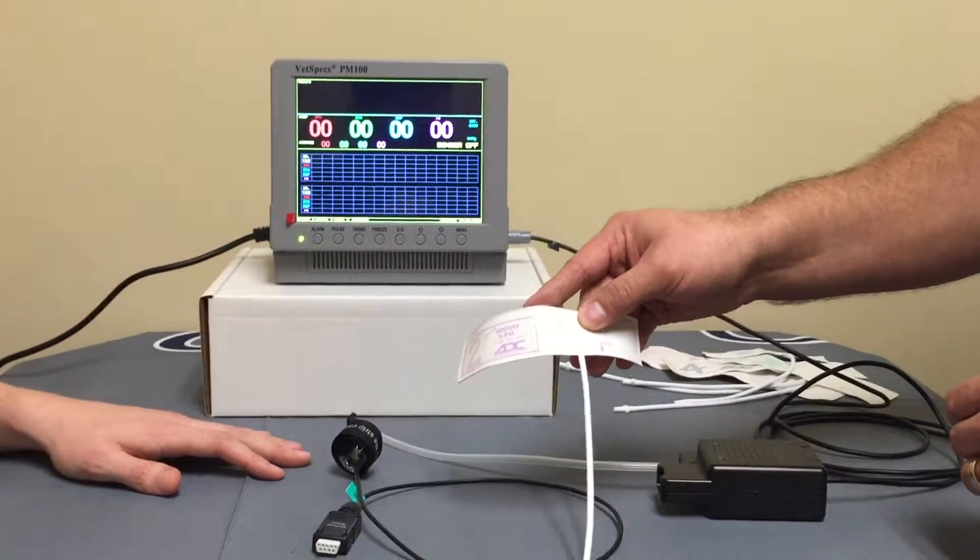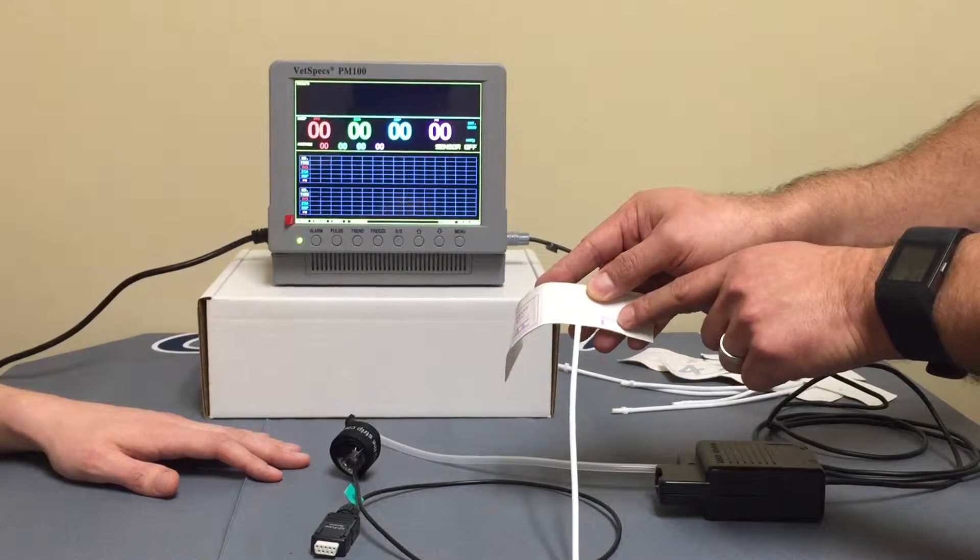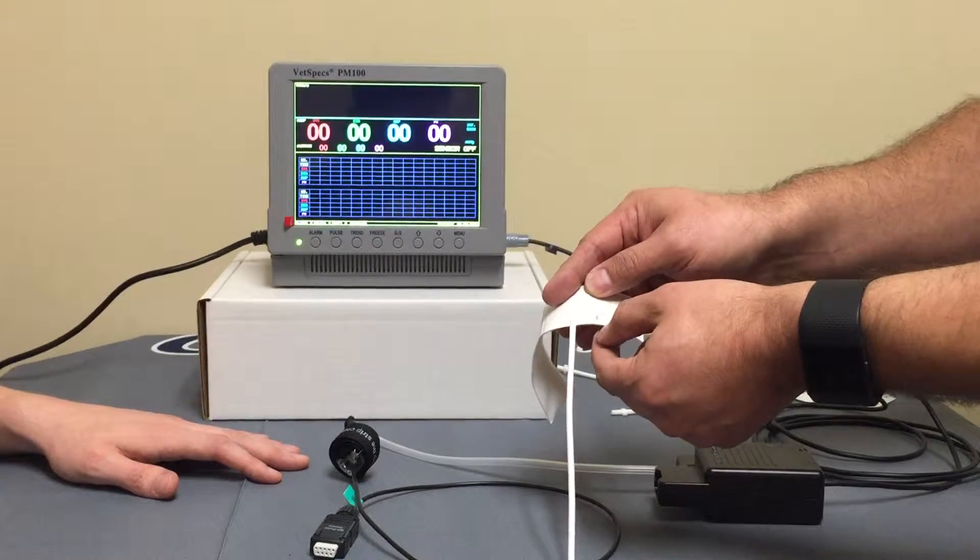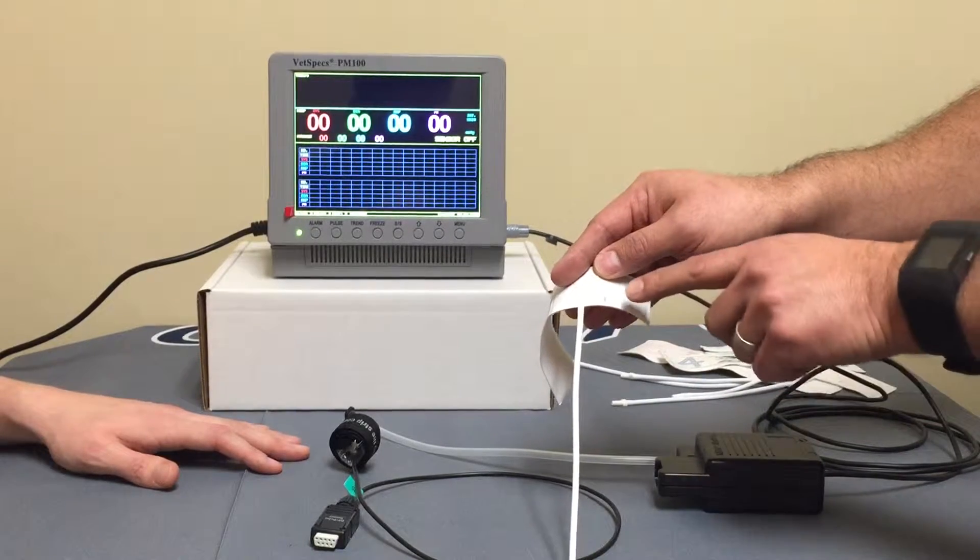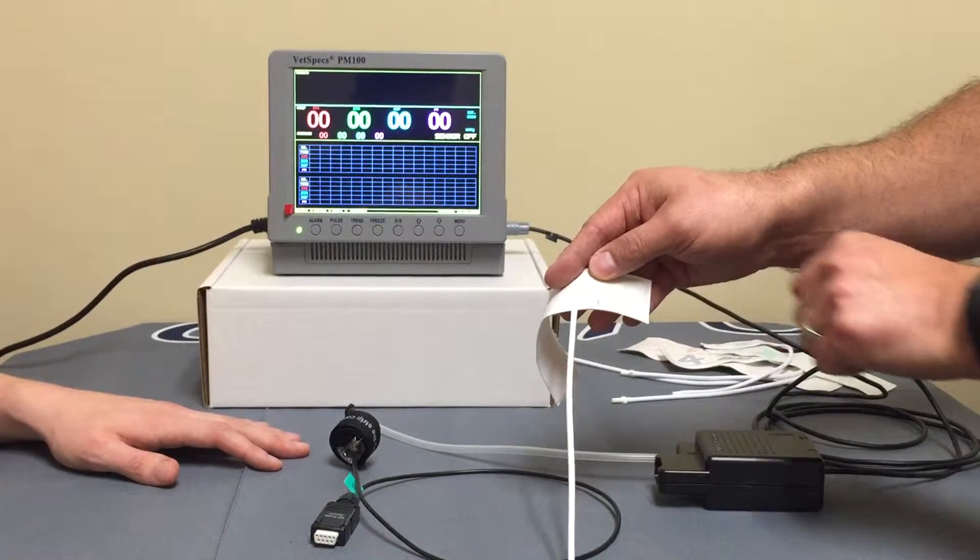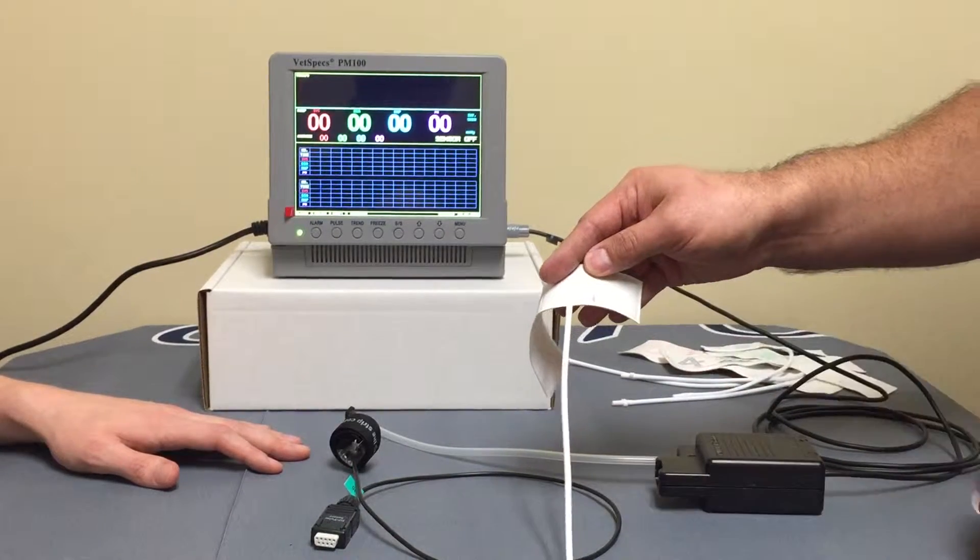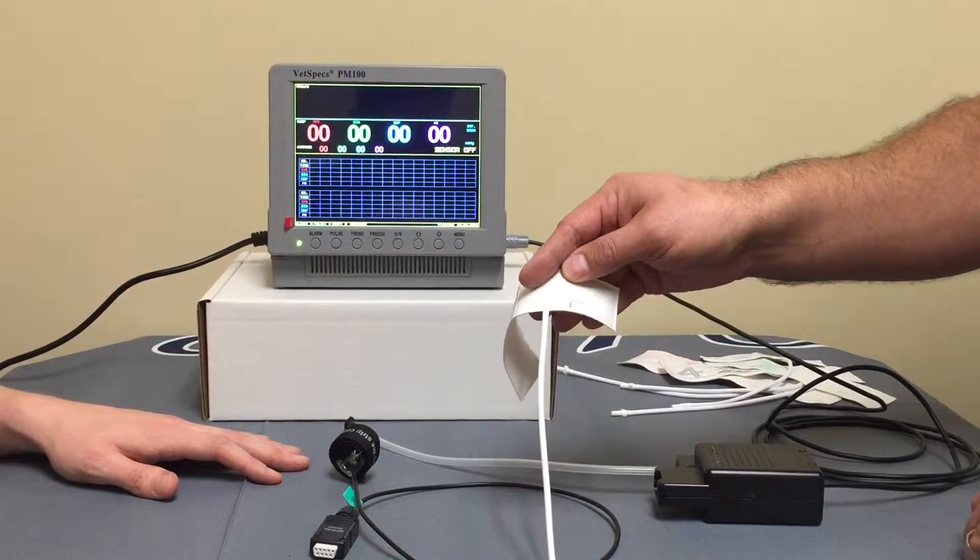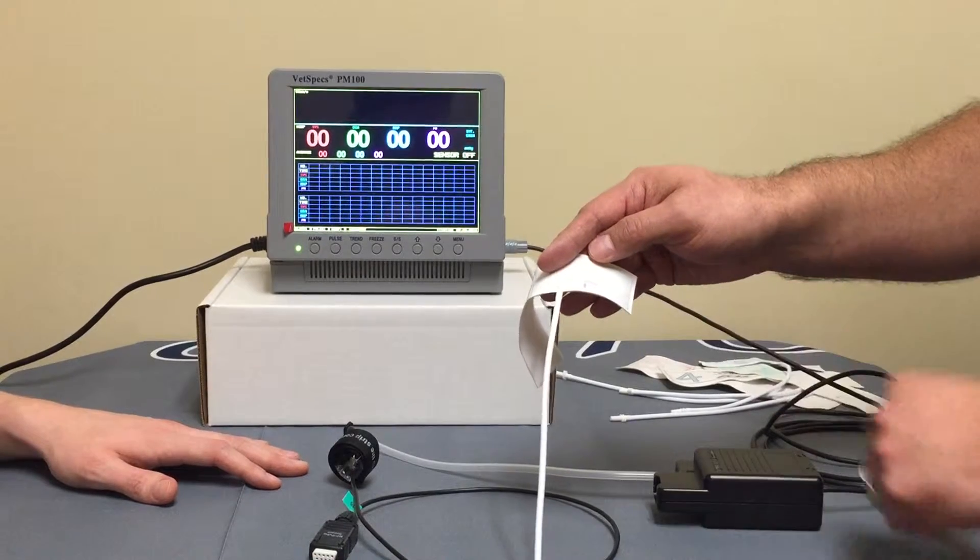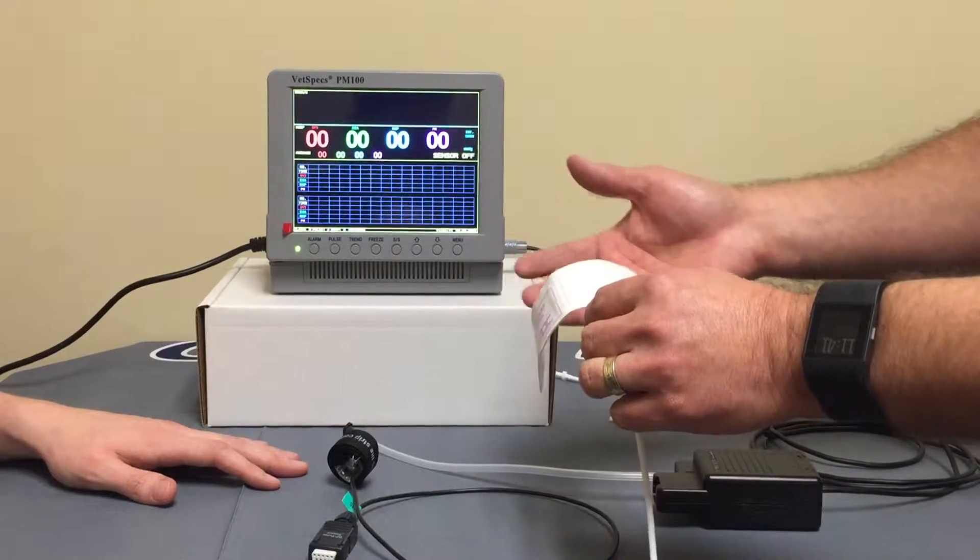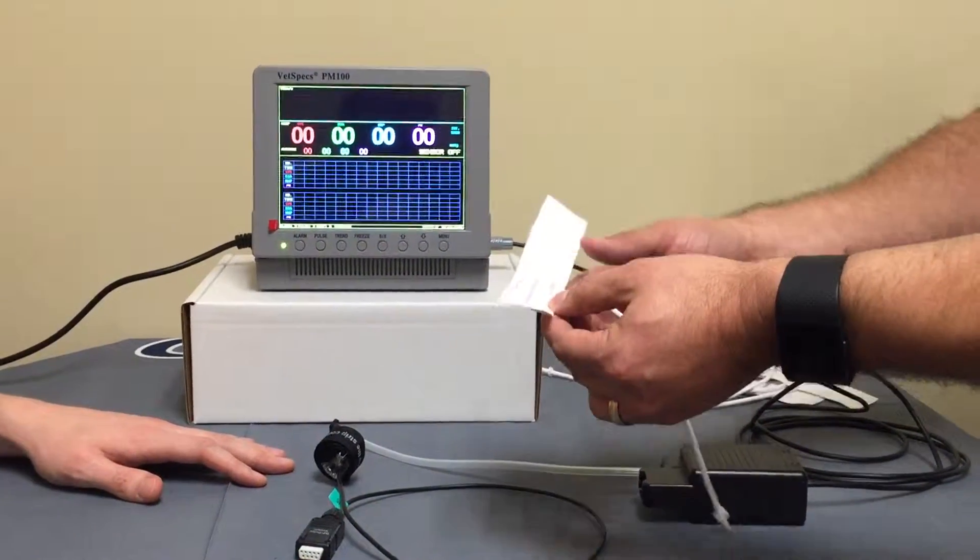One thing that you always want to do when you choose an occlusion cuff is always consider the artery message on the cuff. It's always important to make sure that you identify where the artery is at in that particular limb, and then when you place the cuff, make sure that the word artery—this has an artery wording and then also an arrow. Some cuffs will even have a little circle with a line through it indicating an over artery message. The next thing is when you choose the limb, again try to go with a cuff that would be the proper size, but there is certainly a way to confirm that. So we're going to go with the number two cuff.